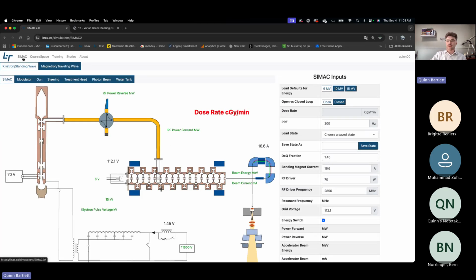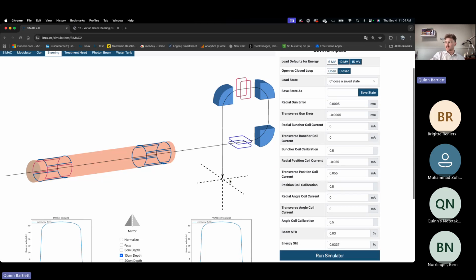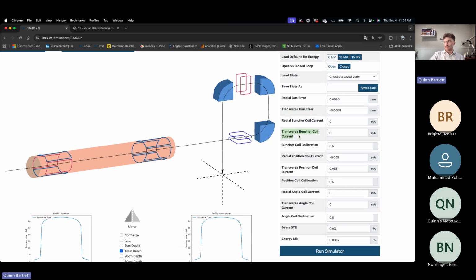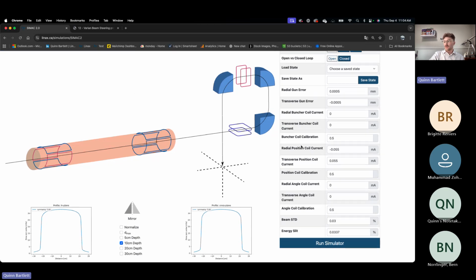We always start by going to Simac, and we're going into Simac 2. I'm going to run it in the Klystron standing wave or our Varian type simulator. When we talk about doing beam steering, where we want to investigate is our steering tab. We ran a 6MV, so we'll do this with a 6MV beam, and we'll head over to our steering tab. In our steering tab is everything to do with the accelerator and our steering coils. You can see we get our radial gun error and our transverse gun error. That allows us to introduce error to our profiles and create asymmetry. Then we have all of our coil currents, of course: our radial buncher and our transverse buncher, our radial and transverse position coils, and then our angle coils as well.